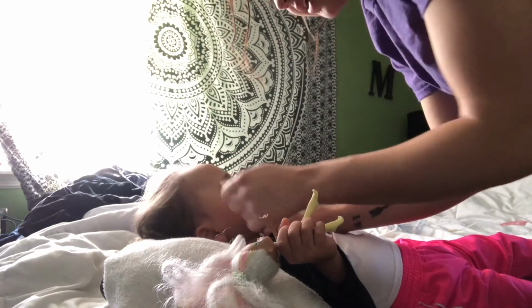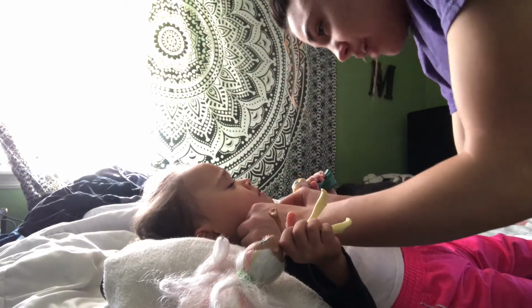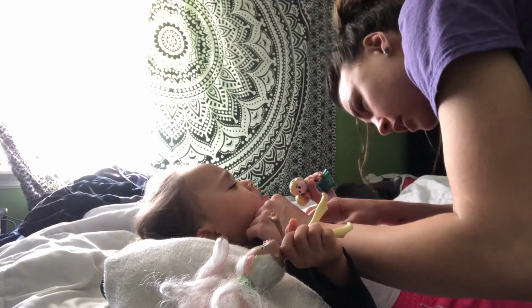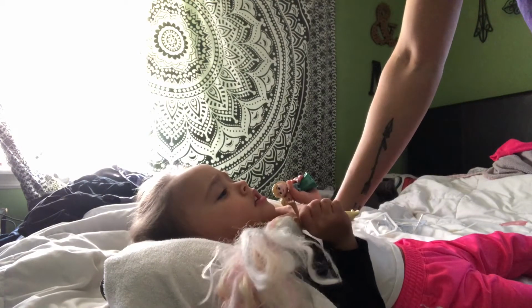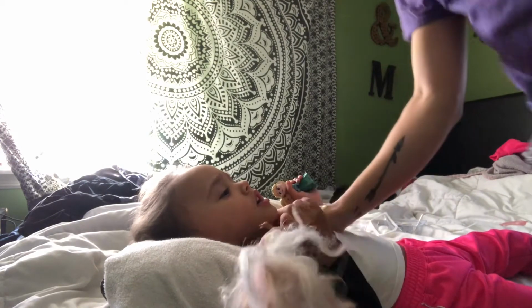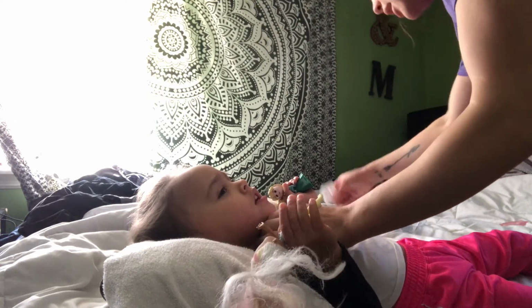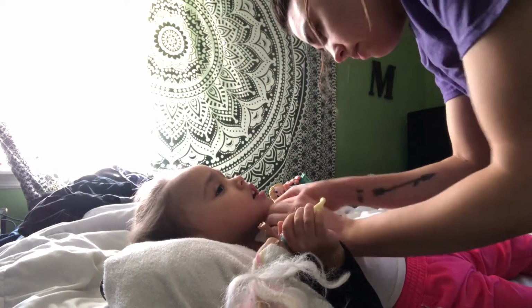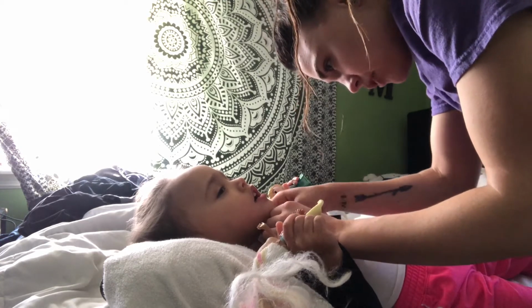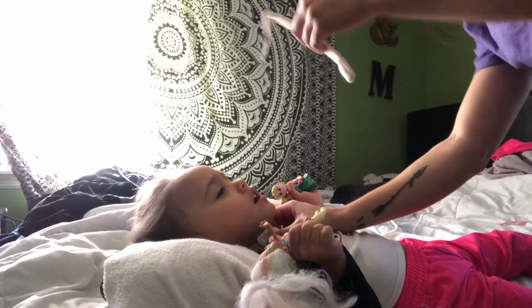All right, let me put your trach ties on. So as you can see, it is scary. There's nothing you can really do about it but try to make them comfortable because it has to be quick. I don't know exactly how it feels, but I always just make sure it's not crooked. And then I make sure it's clean. I put the new gauze underneath. Look, up, up, up. Make sure that's comfortable. It's not folded or anything. There's no kinks in it. And then we're going to put the new tie.